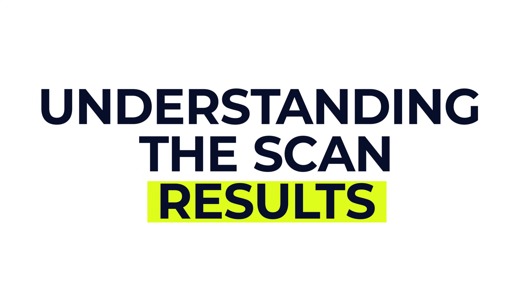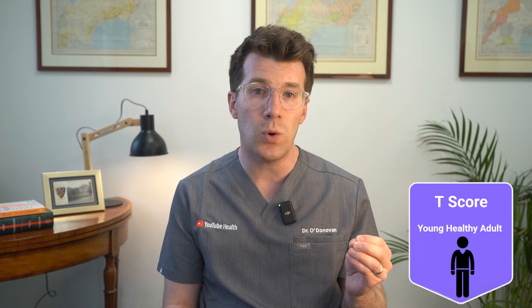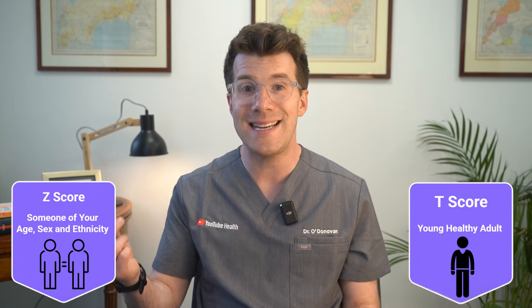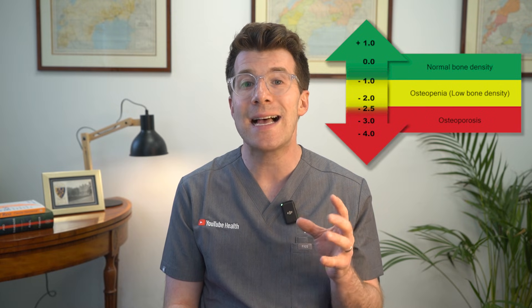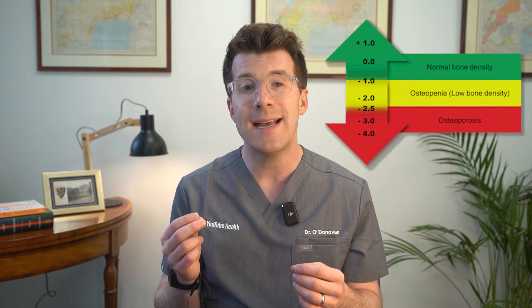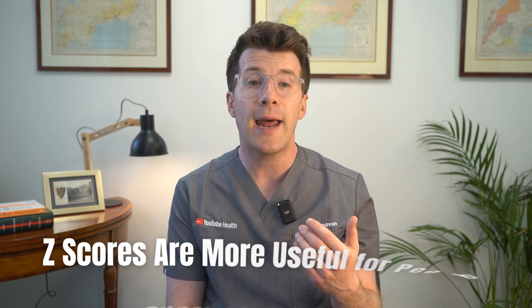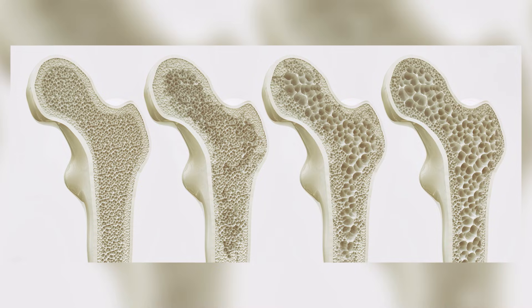So how are the scan results interpreted? Your results will be compared to the bone density of two groups of people. Firstly, a young healthy adult — this gives you what is called a T-score. Then someone of your same age, sex and ethnicity — this is called a Z-score. T-scores are used to diagnose osteoporosis in adults. A T-score above minus 1 is considered normal. Between minus 1 and minus 2.5 is classed as low bone density, sometimes called osteopenia. At or below minus 2.5 is defined as osteoporosis. Z-scores are more useful in younger people under 30 or children, and help to show whether your bone density is lower than expected for your age.